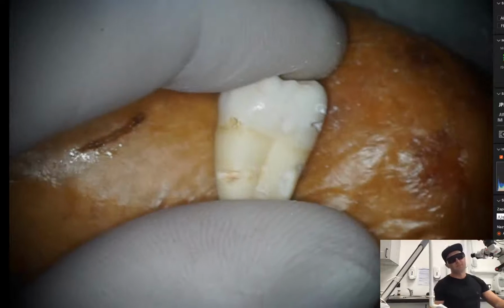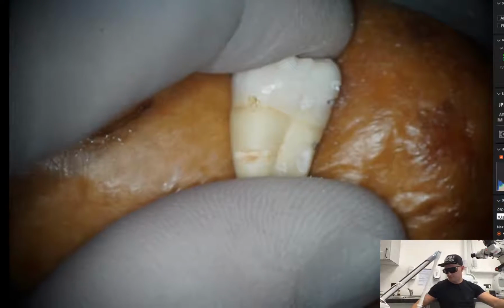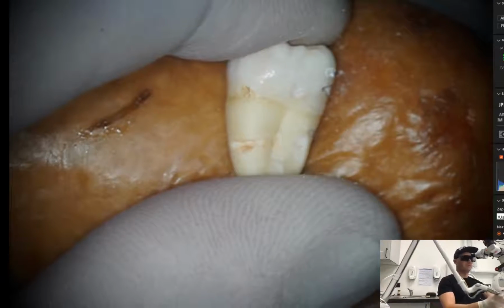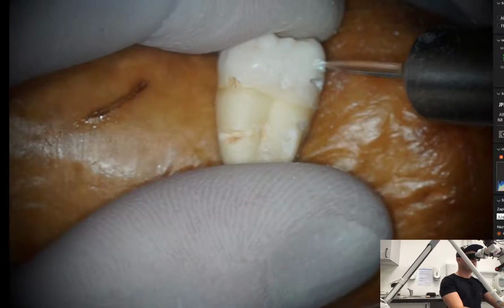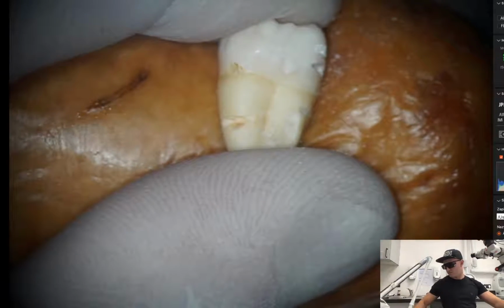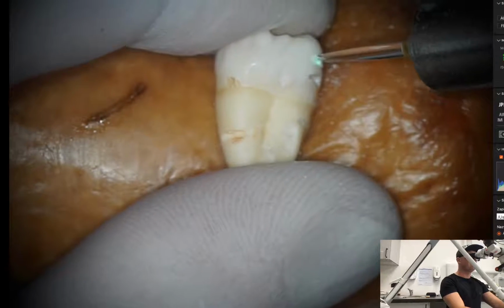Still, I prepare some cavity, but I am not as effective as I was in dentin with this energy level, because I could increase the energy, but I additionally gave some water to promote my ablation process.